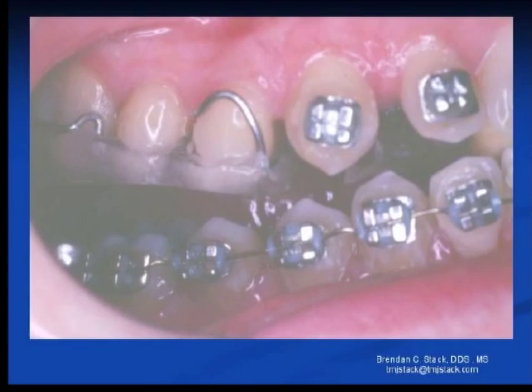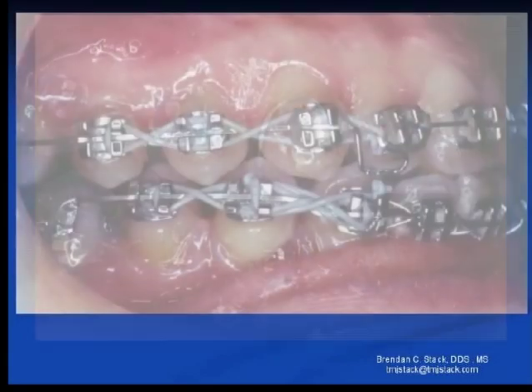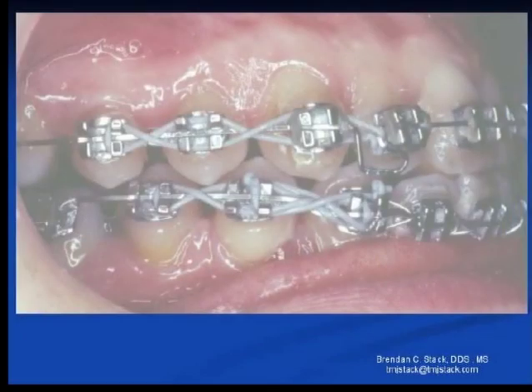This is the next wire on the lower arch without the loops. It is a continuous stainless steel arch wire, and you can see it from both sides with the maxillary expansion appliance in place. What we are doing is closing the spaces now with elastic thread. The teeth are touching each other, and you can see they are doing so without over-rotating or over-closing the mandible, because the overbite is not increasing. In fact, the overbite is 0, edge to edge, and the teeth are in contact on the buccal segments.